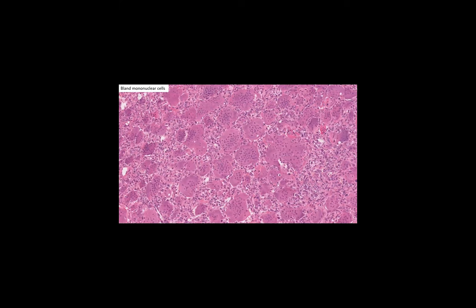If we take a closer look, we can see that the mononuclear cells in the background are also very bland. They're uniform, ovoid to maybe slightly spindled. And the nuclei look very similar to the nuclei of the giant cells.